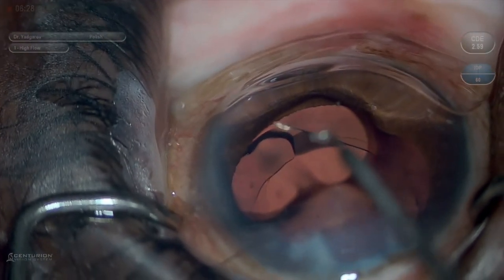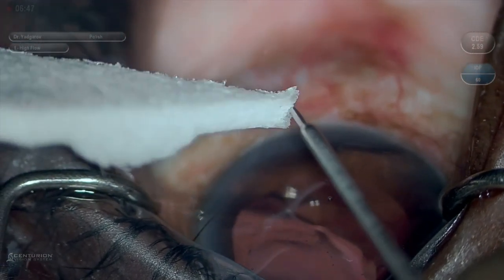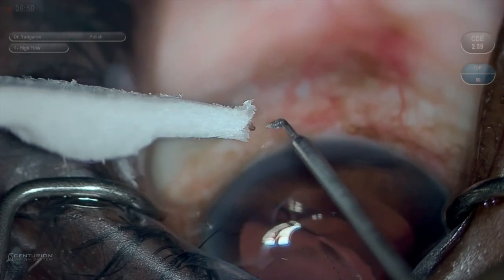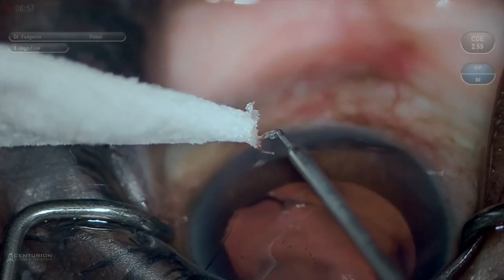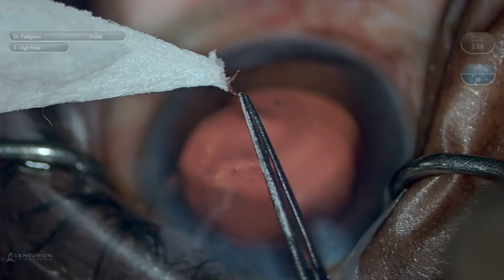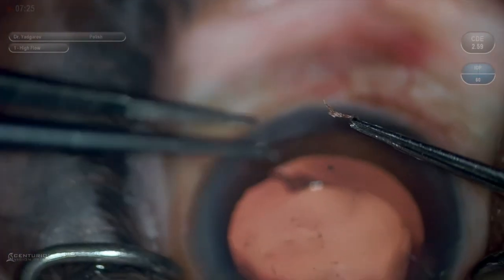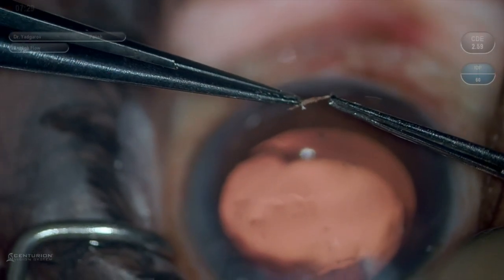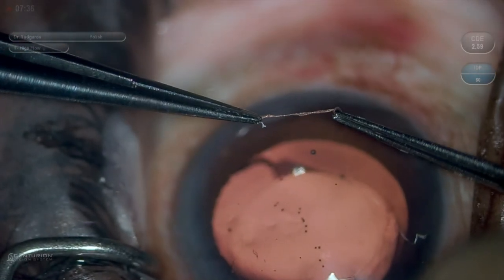You are now looking at that ball of trabecular tissue within that trap. I am visualizing it and noticing that it is just a round glob — it looks like it has been coiled up or accordioned in that trap and is not really looking like a strip anymore. To prove that this is indeed a strip of trabecular meshwork that has been very well coiled, I will take tying forceps and grasp each end. And in this case, you will see that it unravels very nicely and you do indeed have an entire excised trabecular strip, all done without a blade.